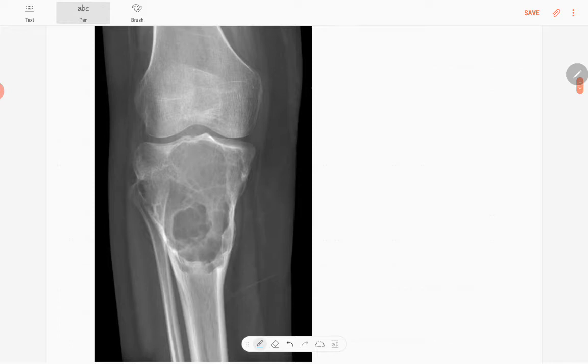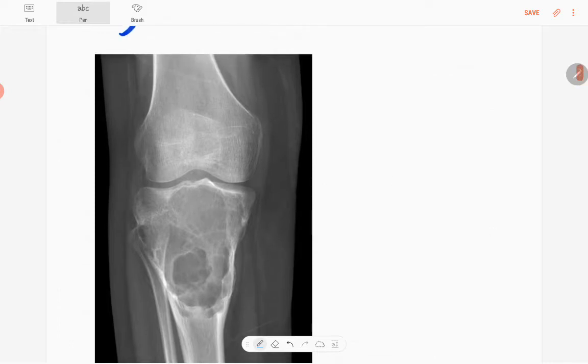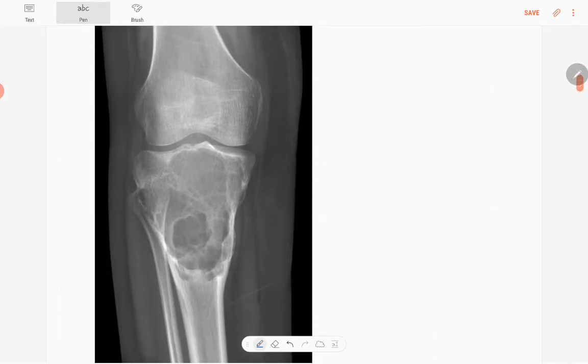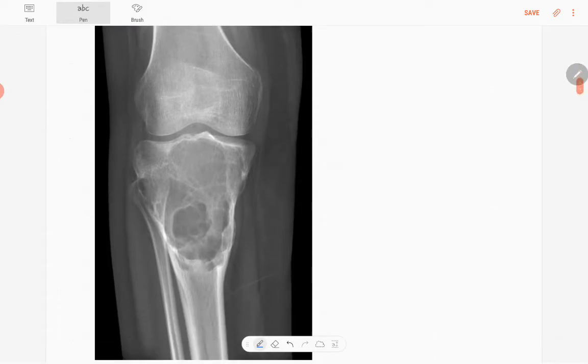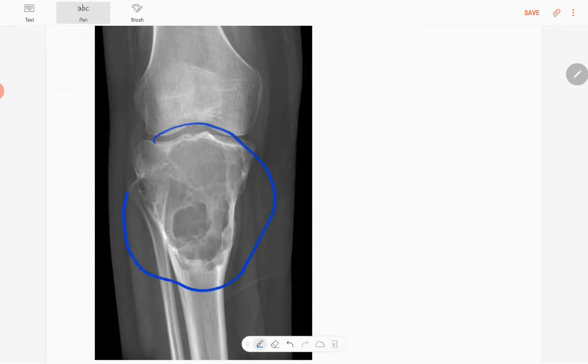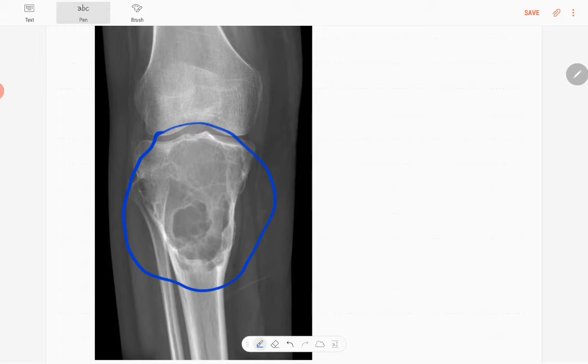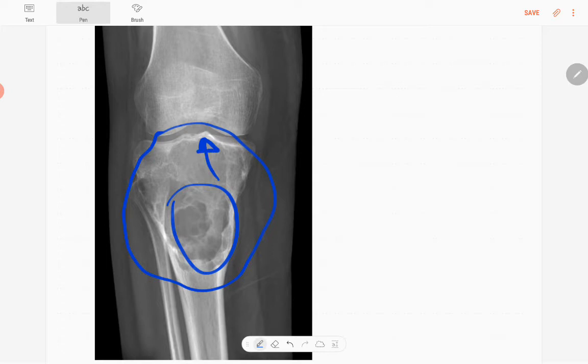In this skeletally mature patient, the abnormality is in the tibia. It is located in the mid-metaphysis and extends to the epiphysis subarticularily. It's a well-defined or geographic type of lytic lesion.